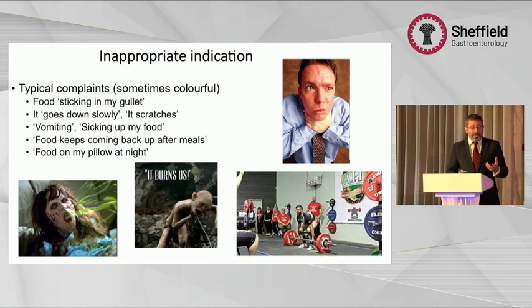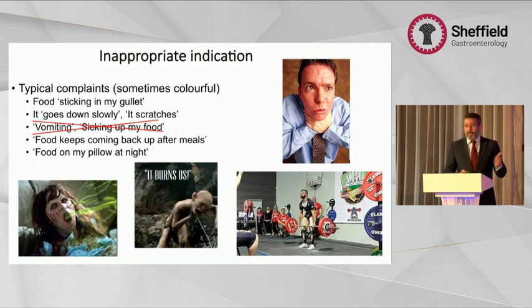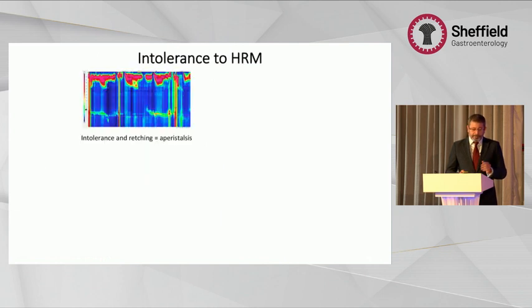And vomiting is in fact not an indication. In fact, it is a contraindication for physiology. If patients present with vomiting and that is their primary problem, or epigastric discomfort or whatever, things outside of the esophagus, we should not be referring these patients for physiology.